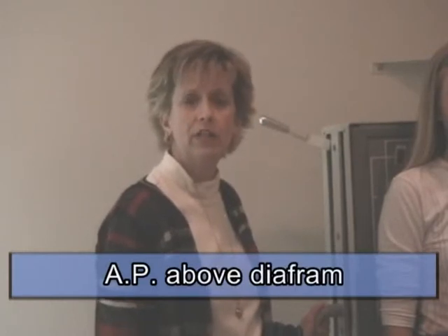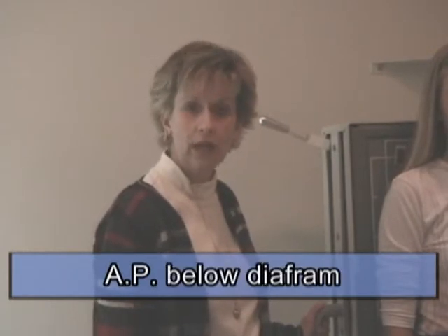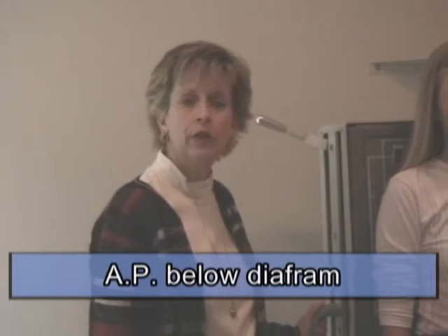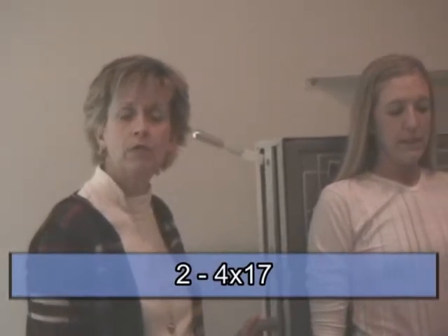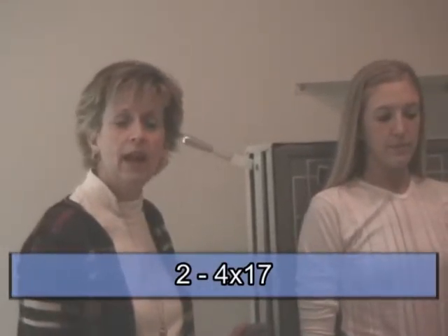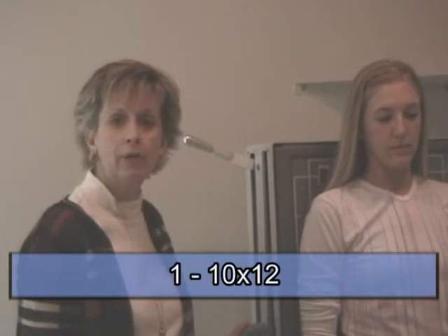We're going to be demonstrating a rib procedure for you today. We're going to be focusing on a series of 3 projections. You're going to be doing an AP for above diaphragm, an AP for below diaphragm exposure, and an oblique for above diaphragm. So that's 2 14 by 17 films for above diaphragm images and 1 10 by 12 below.